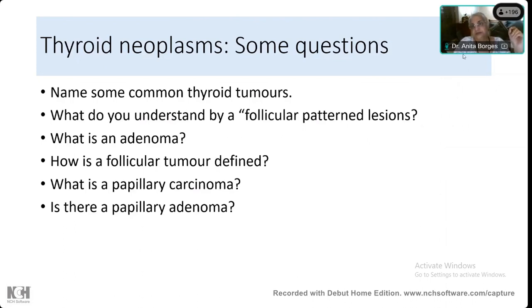It is always well demarcated, ma'am. Always well demarcated. Anybody want to add to this? Totally surrounded by a capsule. No capsular invasion. That is excellent. Diksha, you should have seen this when you studied your Hurthle cell adenoma, that all adenomas in the thyroid, by definition, are surrounded by a capsule.